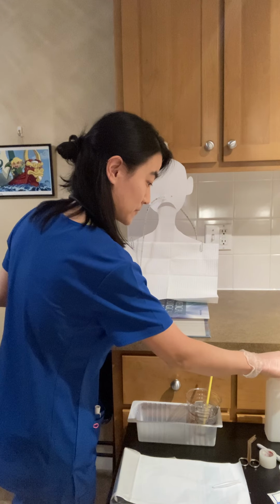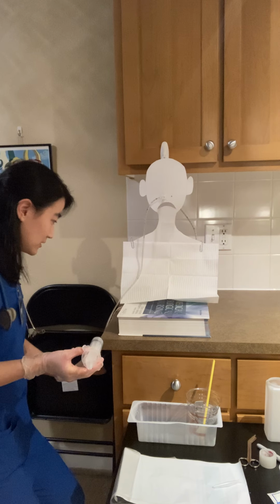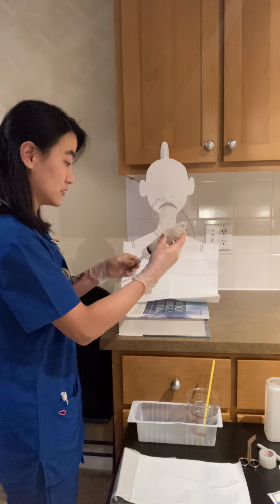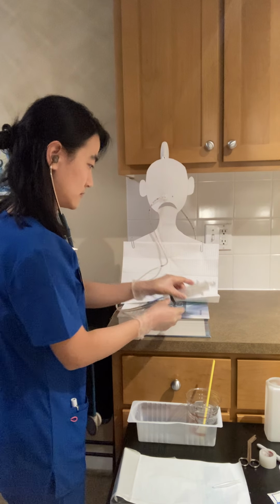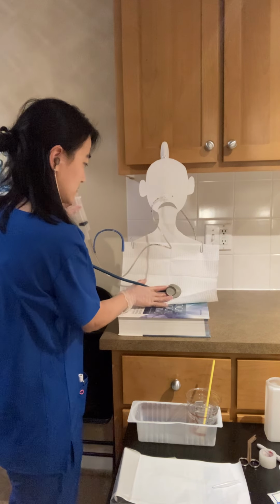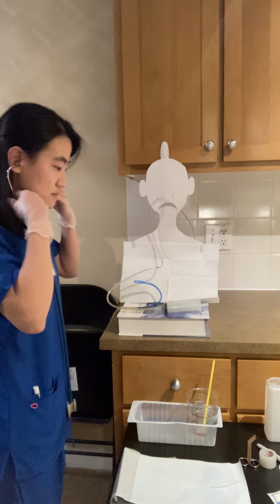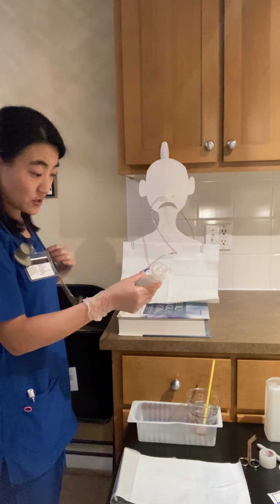All right, so the lungs sounded good, and it didn't indicate that there was anything abnormal or any changes. Next, I am going to inject some air into the nasogastric tube, and I'm going to listen to his stomach to see if I can hear the sound of air bubbles. Alright, so I was able to hear the air bubbles in there.